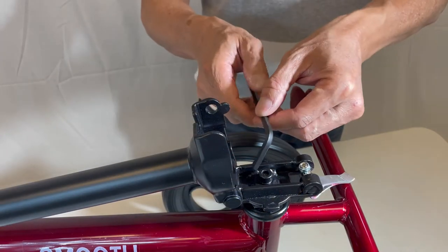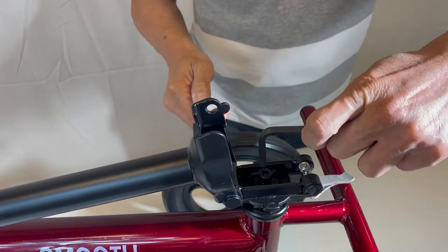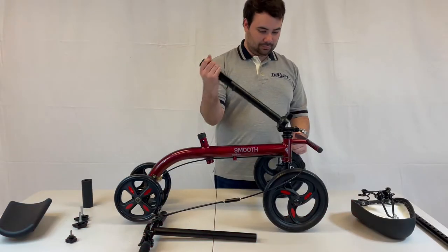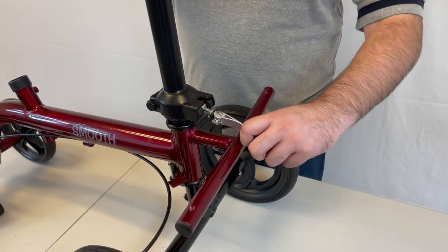If the steering alignment needs to be adjusted, loosen the allen screw and move the front wheel alignment parallel to the handlebar before re-tightening. Raise the steering column to its upright position and lock in with its lever pin.